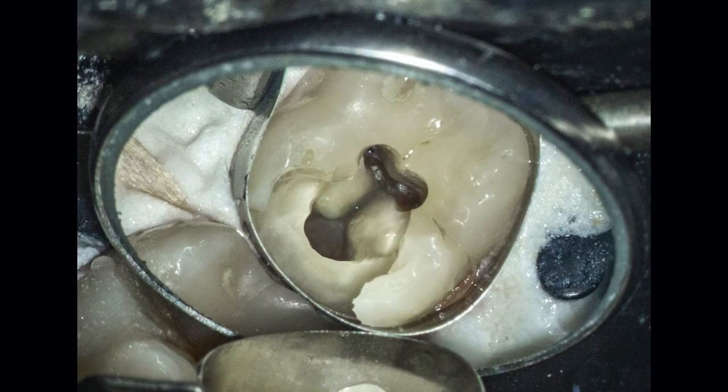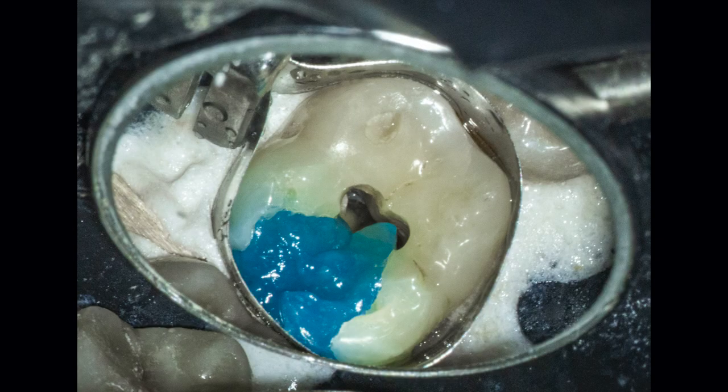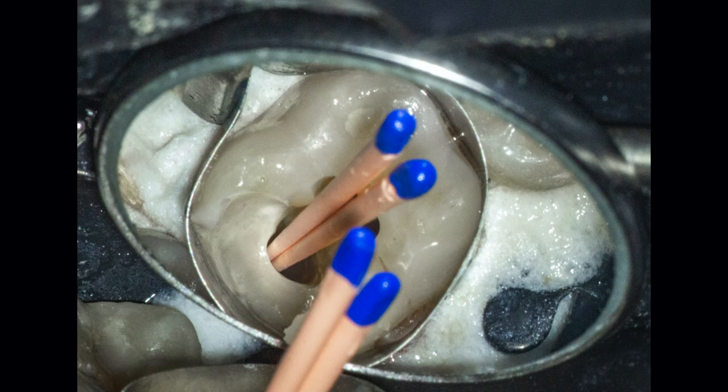I'll first open the canal orifices to about a 20.08, enough to accommodate a large gauge gutta percha cone. I'll then place a matrix band and etch the site, and then I'll take about size 30.04 gutta percha points and ply them into the canal that I do not want material to flow into.